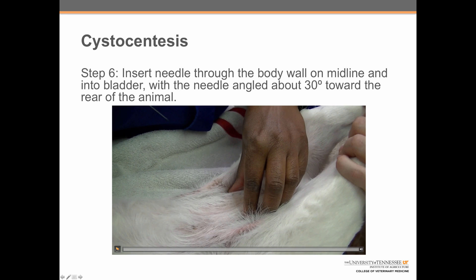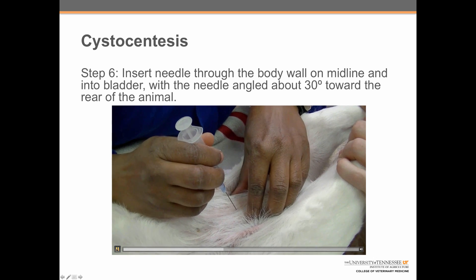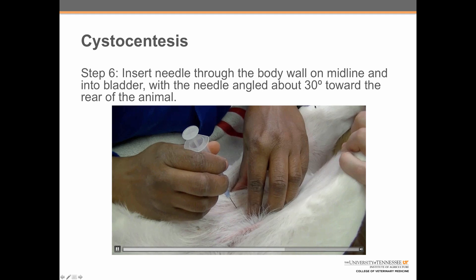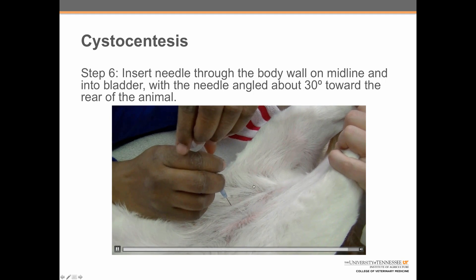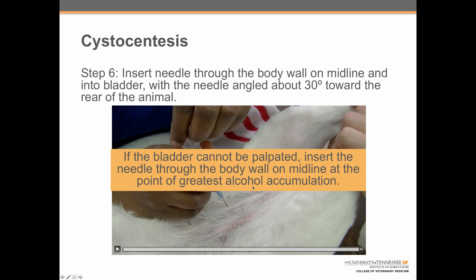Step six: insert the needle through the body wall on midline and into the bladder with the needle angled about 30 degrees towards the rear of the animal. This is done with the bladder stabilized to keep it from getting away when the needle goes in. In cases where the bladder cannot be palpated, the needle should be inserted through the body wall on midline at the point of greatest alcohol accumulation.